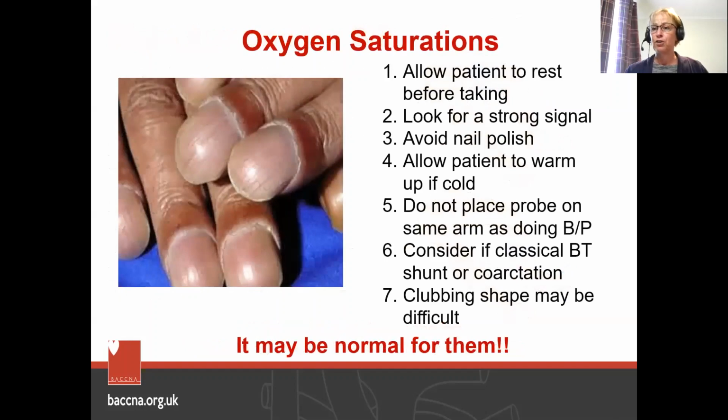So we'll have a little look at oxygen saturations now. An accurate oxygen saturation is an important assessment of the patient with congenital heart disease and needs to be performed well. So try and ensure that the chosen site is warm and well perfused. Apply the probe to the site, ensuring the sensor is correctly positioned with the light source at the top.